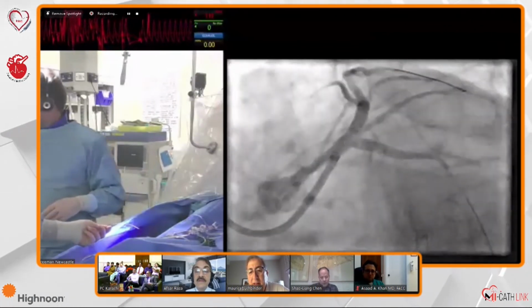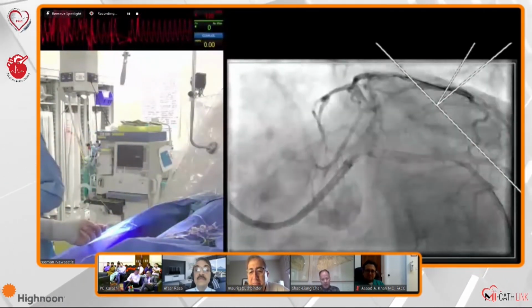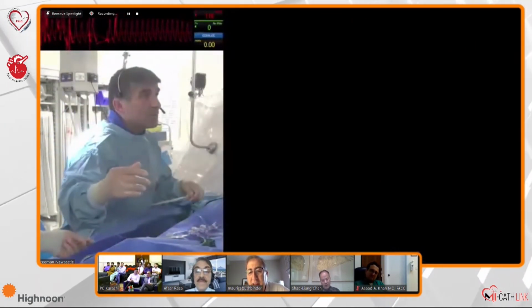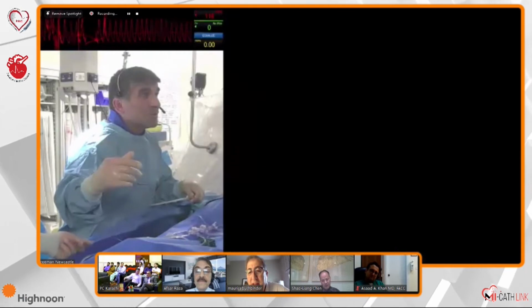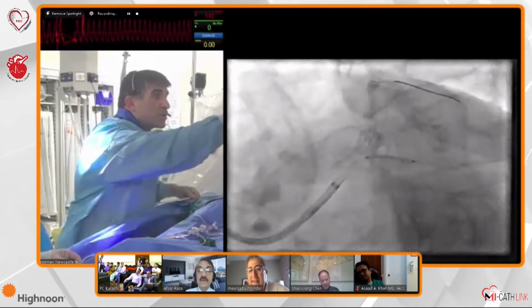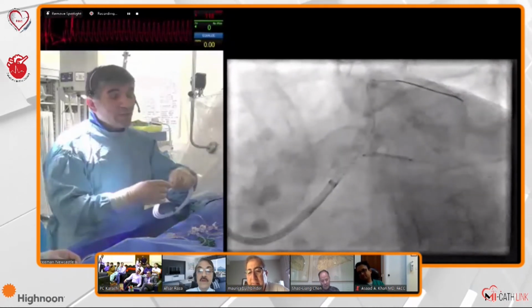So how far did you extend into the left main, Dr. Ingrid? It's not into the left main. If you go back, from the complex, did you go inside the left main at all or no? No. Go back. You're just right here, right there. So this is the beauty of this technique.